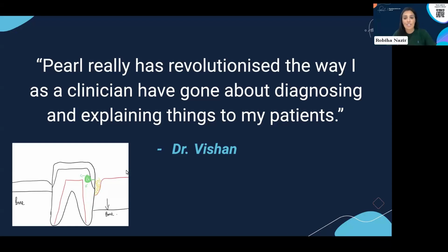Yeah, I think that's a really important point you've just made there, that AI isn't 100% accurate. And even if it was, we should always remember that we are the expert. As clinicians, it's our responsibility to make sure that we are diagnosing and treating correctly. So those tools on the side there are really useful to be able to do that, to edit off or add on things so that you can then show the patient the correct diagnosis detections.